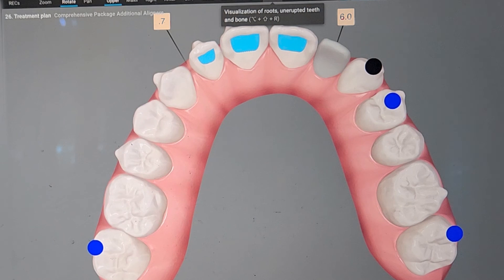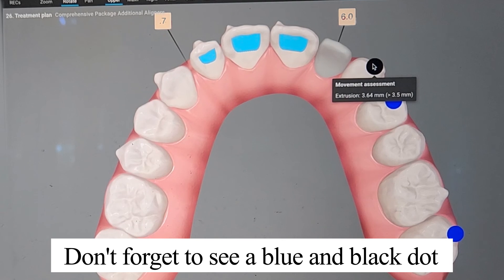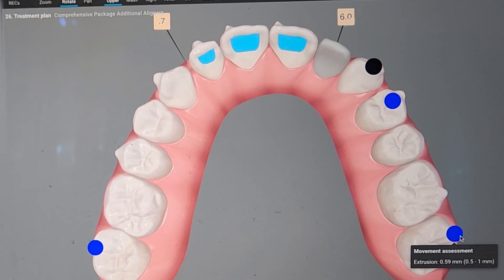Those are just some of my favorite tools on ClinCheck and some of the things I do on every case. Hopefully that is helpful. And don't forget: anytime you see a blue or black dot — rotation, extrusion, intrusion — you want to put attachments on anything with a blue or black dot. Intrusion I'm not too worried about, but yes, we will need to put some attachments on these eventually. Hopefully that was helpful, thank you.